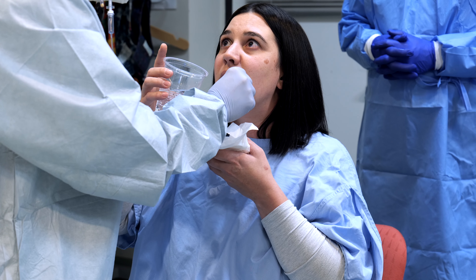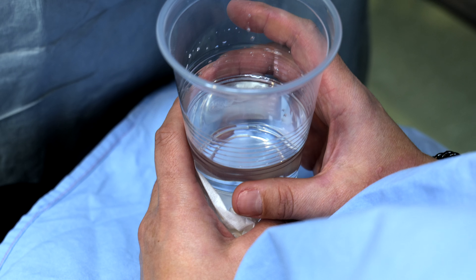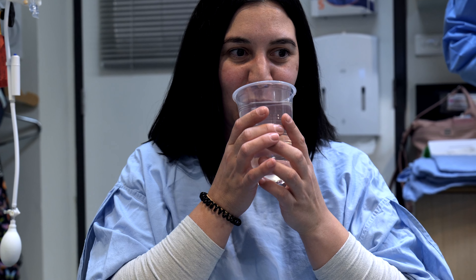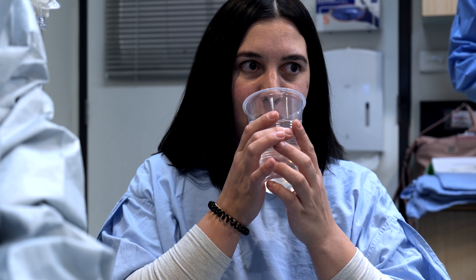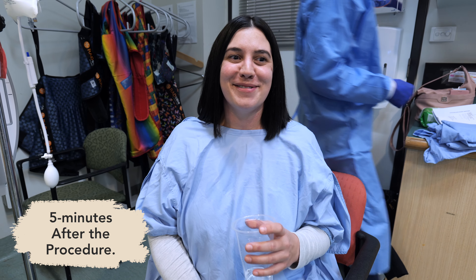My experience swallowing the capsule was initially a bit tricky — just being a larger foreign object, bigger than your normal tablet to swallow. But once I remembered to breathe and drink the sparkling water, it seemed to go down a bit easier. It wasn't painful, maybe not even uncomfortable. It was just about remembering to relax and breathe and drink that bubble water, and then it just seemed to go down quite easily.